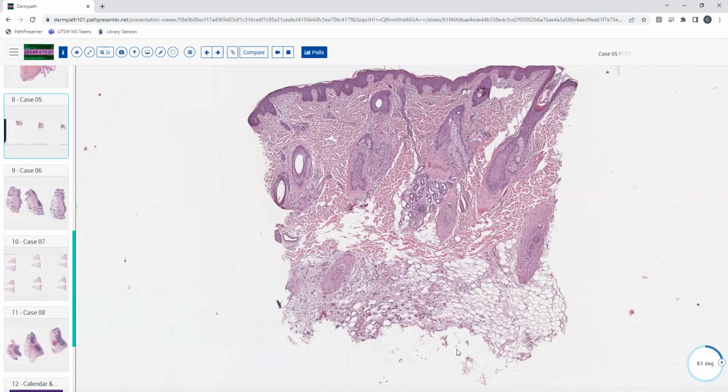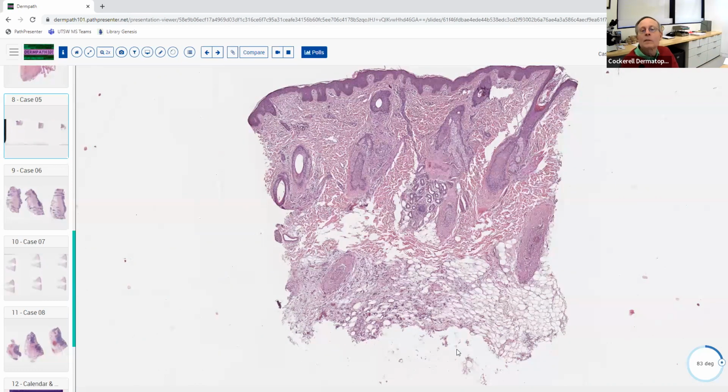Is it like anagen effluvium, like with chemo? Yeah, that doesn't really give you quite that same degree either. It almost looks a little more like telogen effluvium, interesting enough. Talk about anagen effluvium, because when you biopsy it, you still see a lot of the follicles in anagen. The keratinocytes are dead because they get killed by chemo, and it isn't the immune response shifting the follicles into telogen. So it looks a little different, but histologically they're just anagen follicles that are dying, and they're not in telogen yet when you biopsy that.